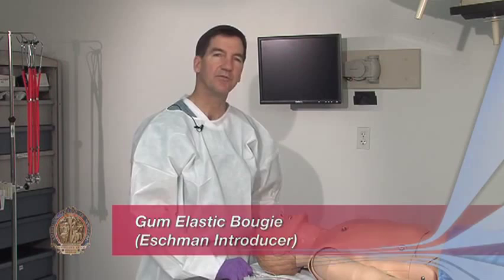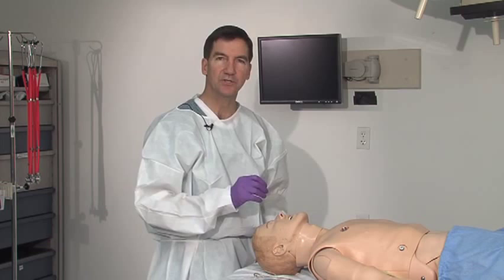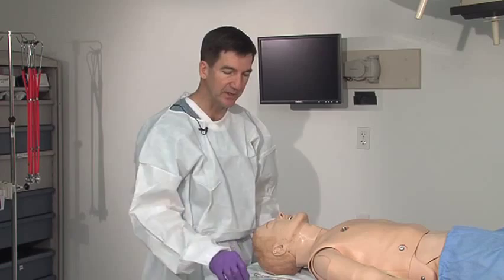Sometimes during resuscitations, adults will present a very difficult intubation situation. In such a situation, perhaps an obese patient or someone with just a very short neck, it will be very difficult to get a good view of the cord. We have an adjunct that can help in intubating a patient like that.